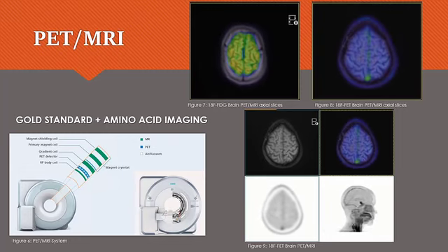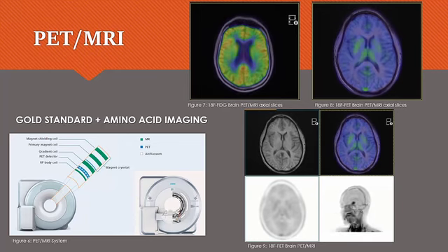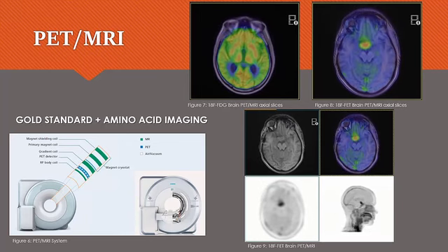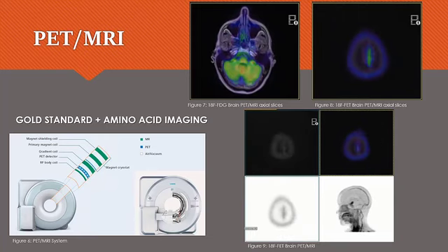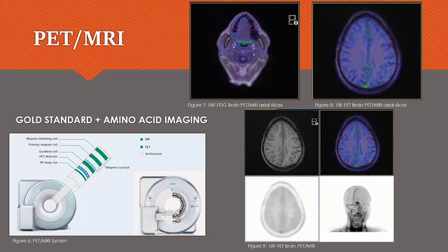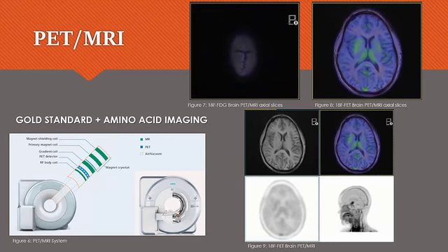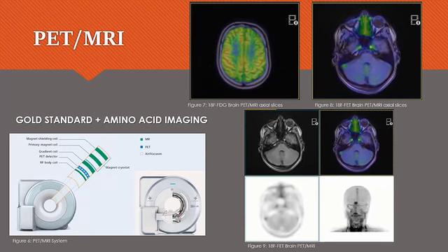The integration of these two modalities allows for simultaneous imaging using both PET and MRI without compromising the image quality of either modality. The addition of PET, and more specifically FET-PET, with the current gold standard for neuro-oncology imaging, has the potential to overcome the limitations that MRI has in distinguishing between malignant tissue and non-malignant tissue.